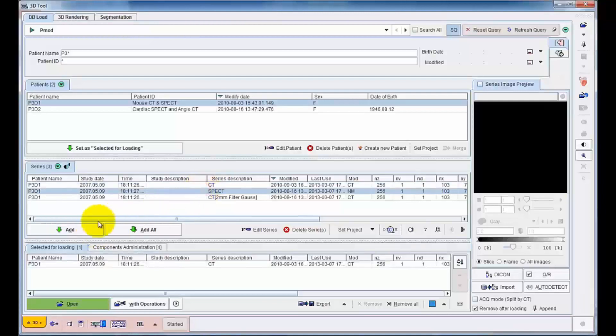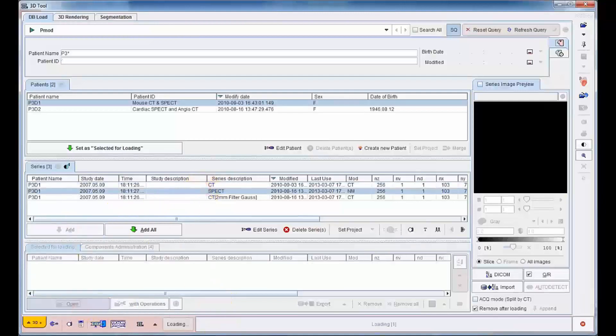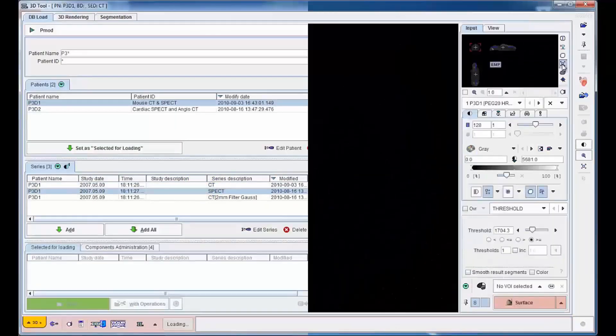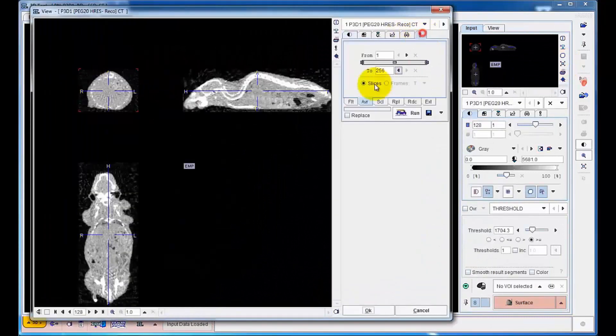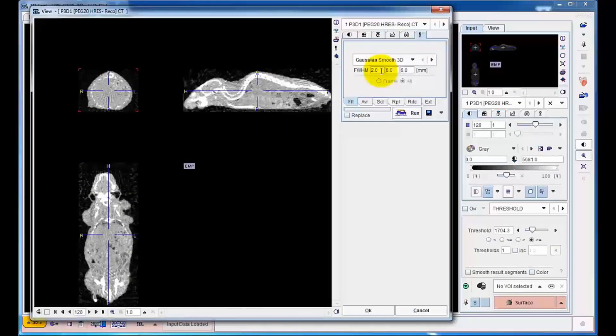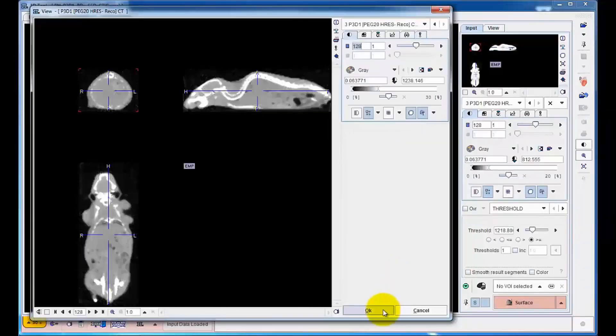CT and SPECT images from a mouse are loaded into the 3D tool. A slight smoothing is applied to the CT image in order to reduce noise, which would otherwise impact negatively on the rendering results.